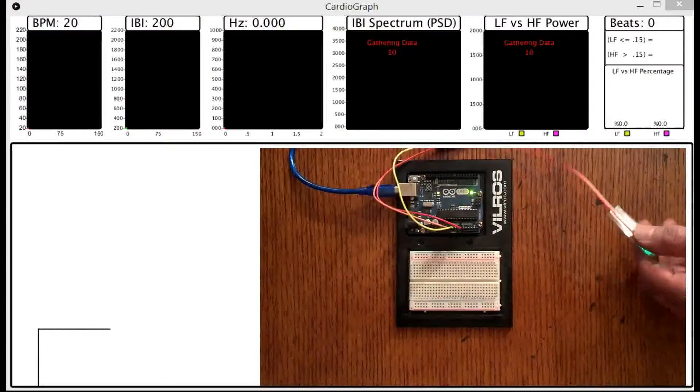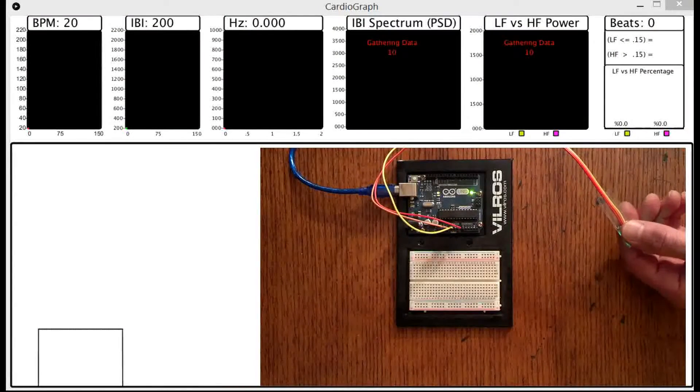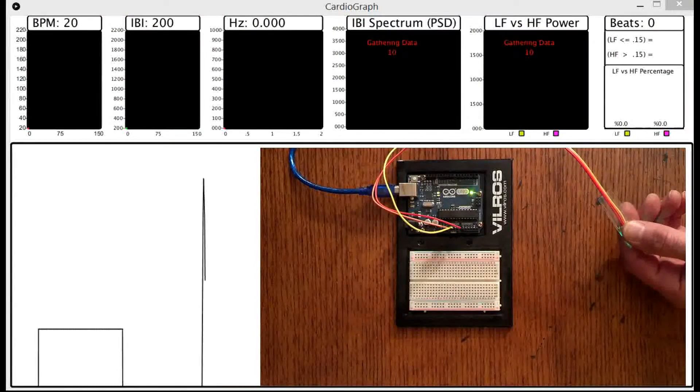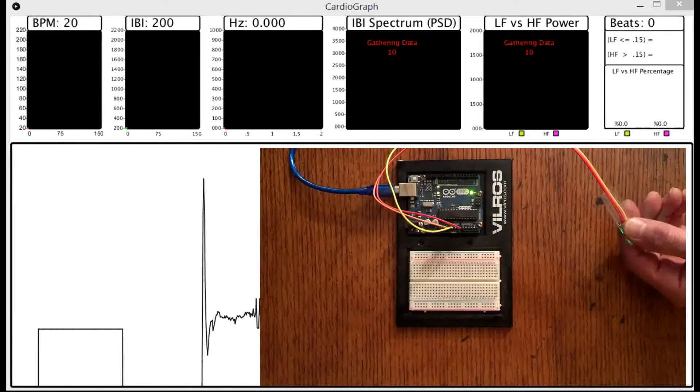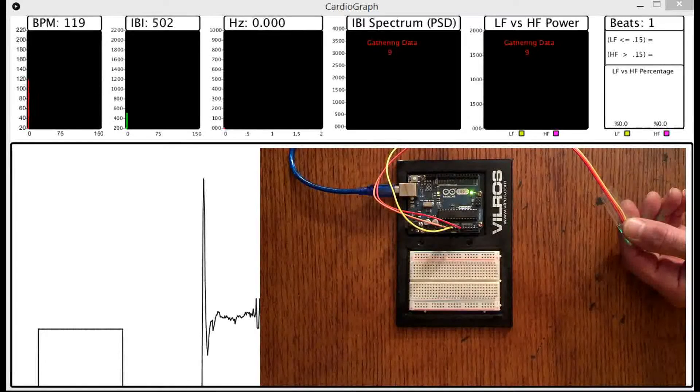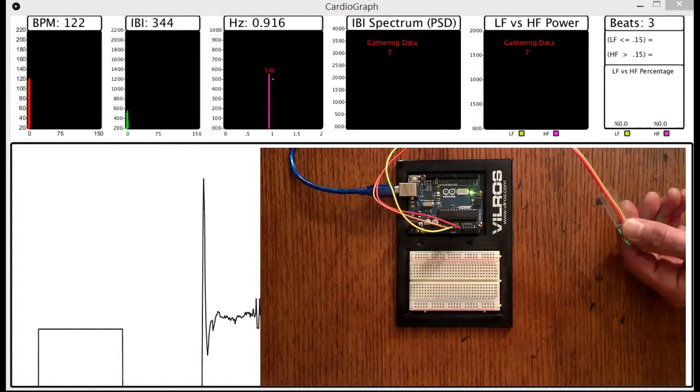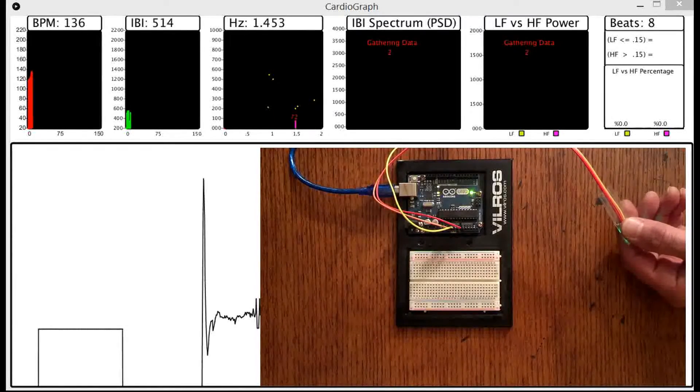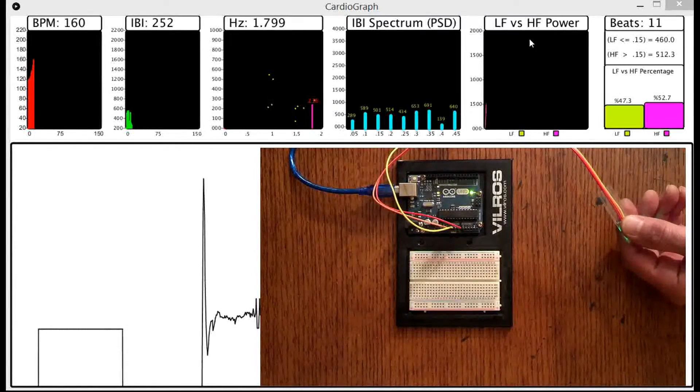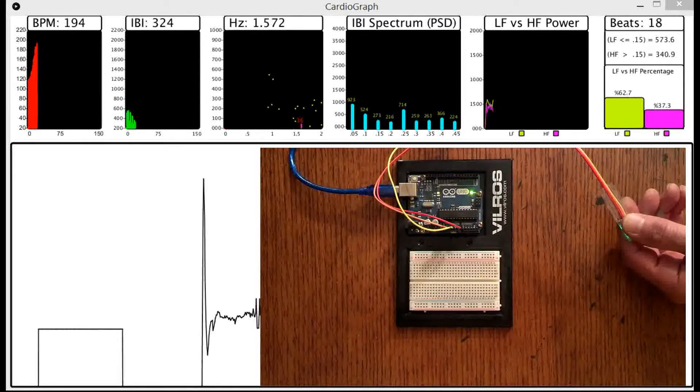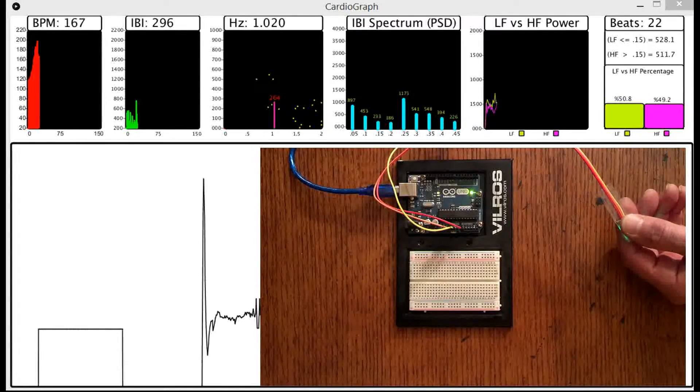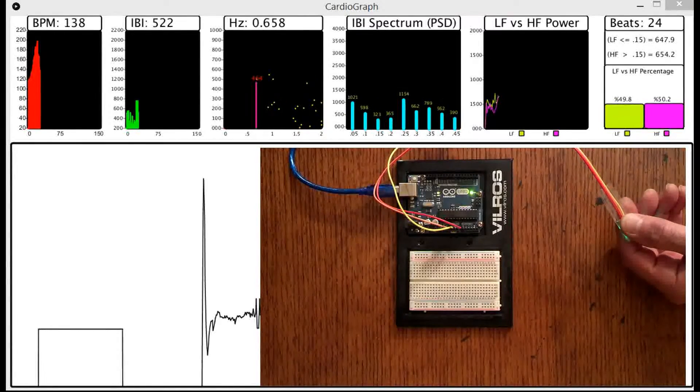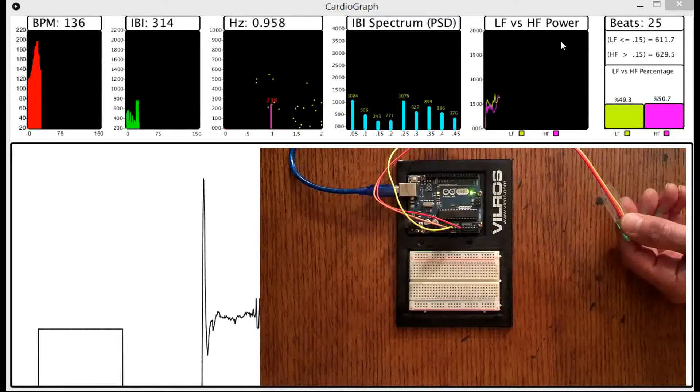So here's my sketch running. This is using Processing 3 Plus. Right now it's just gathering some data. You can see over here. It takes about 10 beats before you've got enough data here to fill up this PSD graph.